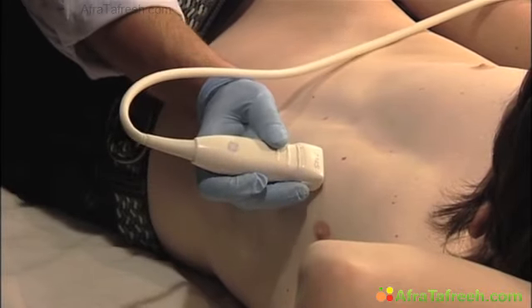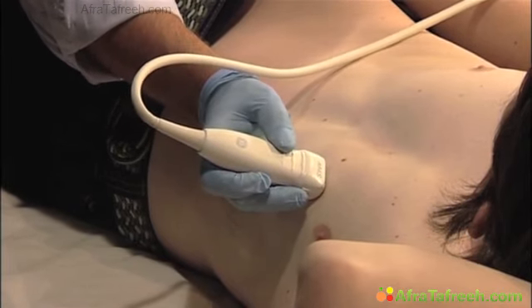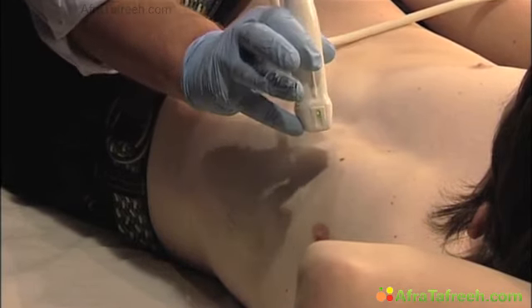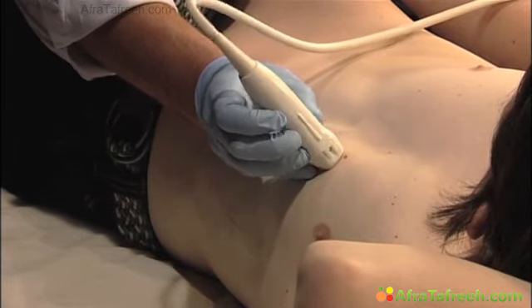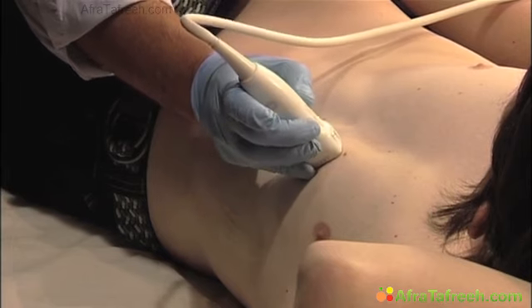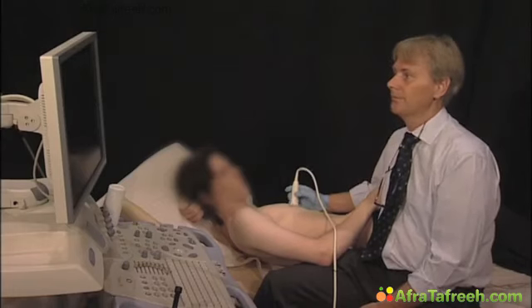And the other thing which is very important is that when you rotate, at least that's what I would do, I have my little finger, and my little finger kind of gives me an anchor here. You see, this is the anchor, and when I rotate the transducer, I always know where I am, and I don't lose the position while rotating.